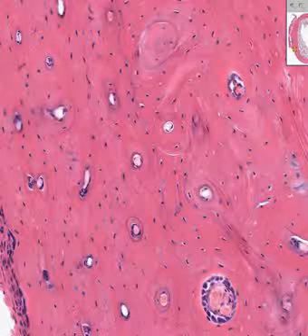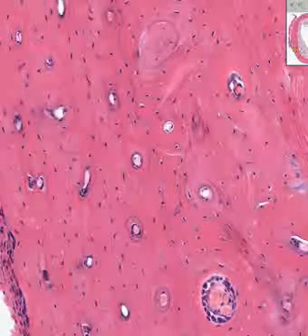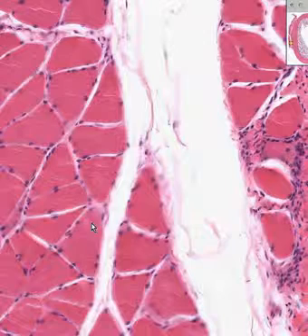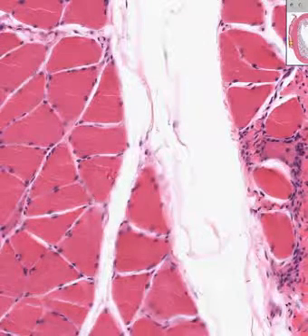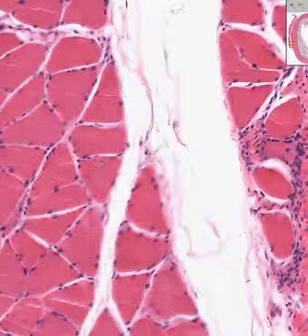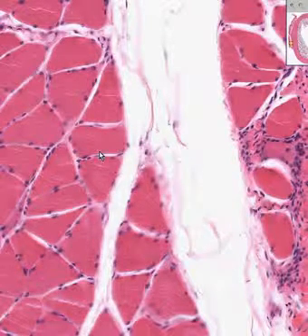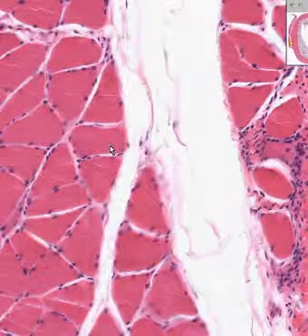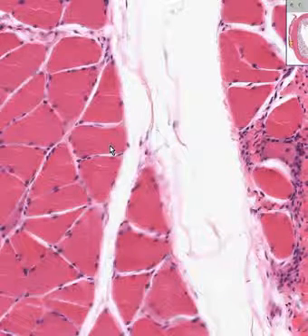Last but not least, because we are calling this shotgun histology, we've already seen the marrow. I want to show you one more little picture towards the periphery of this bone. And I think you could instantly recognize this as being skeletal muscle. You can't see the striations very well, but you can see the fact that they are big fibers and they are cut transversely with respect to their longitudinal axis. And you can see that all the nuclei are out at the periphery. So boys and girls, here we have a mature, cortical, dense Haversian bone. And I thank you very much.